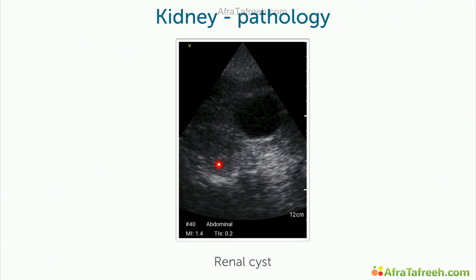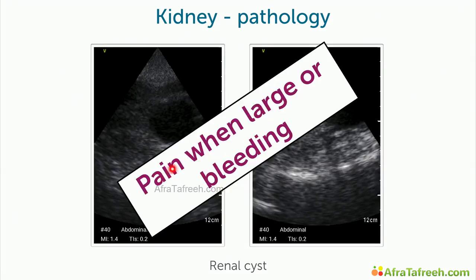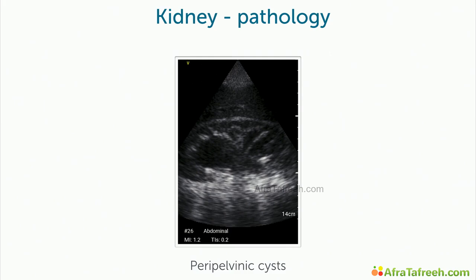A very common pathology, which doesn't cause any harm or pain to the patient, is a renal cyst, which is depicted here. These cysts are only harmful to the patient when they are very large or they show signs of inbleeding, and then they can cause pain.